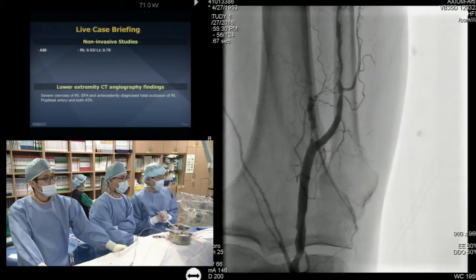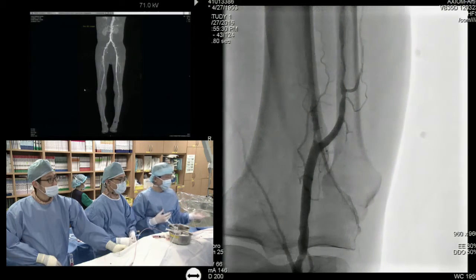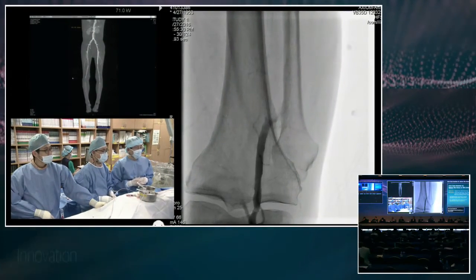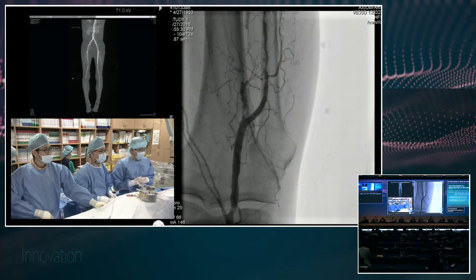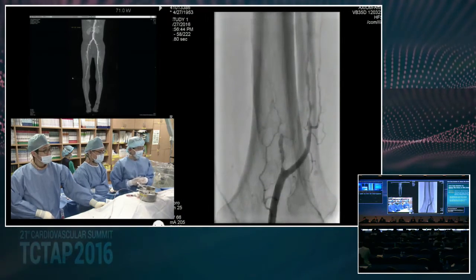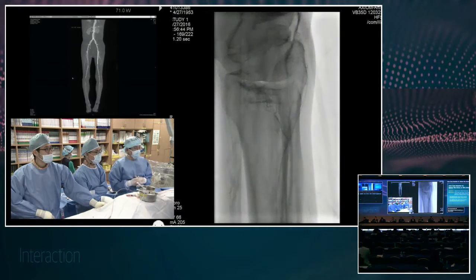So, the left side has a much bigger ulcer, and the patient cannot wait for treatment on this right side. The left side foot was already treated previously. So today's target is the right side BK artery, and this side is also a Rutherford 5 CLI foot. So today, I took ipsilateral antegrade puncture, right common femoral artery, and I already inserted a 4.5 French sheathless guiding catheter to the pop. And I started the guide wire maneuver for the ATA.